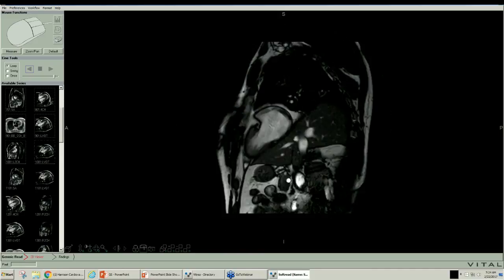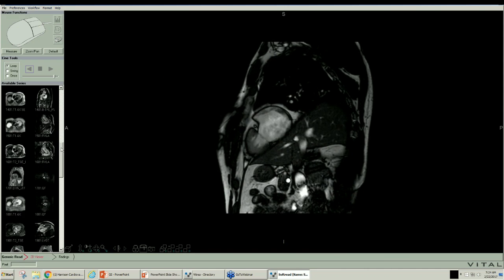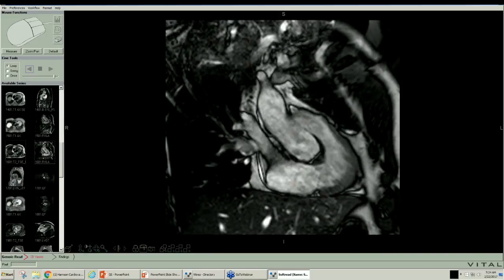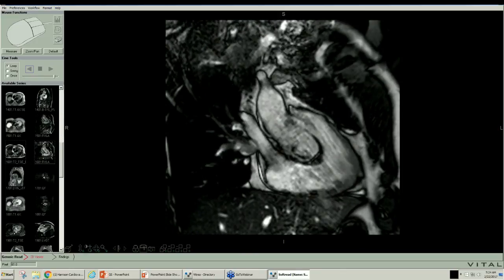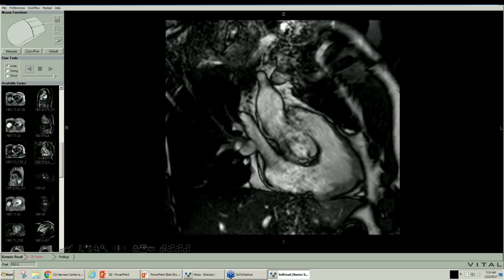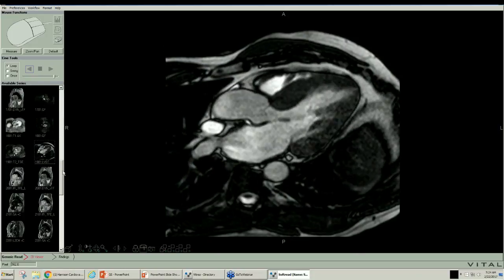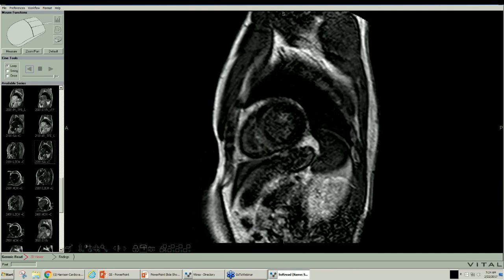And so we like to see in every way we can see right ventricular and left ventricular activity to be able to make the measurements we want. And you can see the aorta, superior vena cava, right atrium, tricuspid valve, right ventricle, right ventricular outflow tract, and the beginning of the common pulmonary artery. And let me pull some more images down for you. These are beautiful images. This tells you what we can find out.